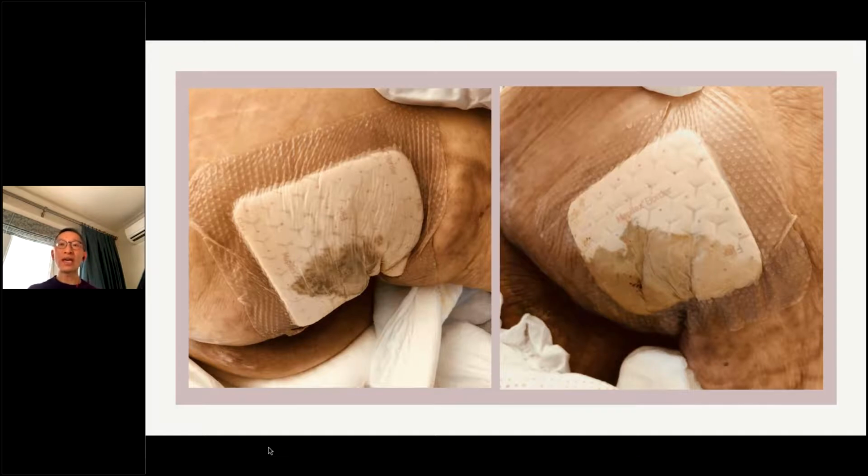So I want to share with you a few cases here. This is the first patient. She is from a complex continuing care setting, and she has problems with mobility. Like a lot of patients in complex continuing care and long-term care facilities, they like to be very sociable. They like to be sitting up in a chair for most of the time. And that's what she's been doing, and it resulted in a pressure injury on the ischial tuberosity. The problem is she likes to be sitting in a chair and refused to be changed until she went back to bed. So on the usual day, she'll be sitting in a wheelchair for a prolonged duration, from 8 hours to easily 12 hours from time to time.